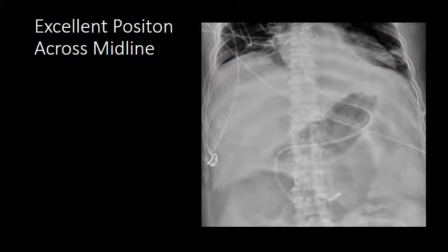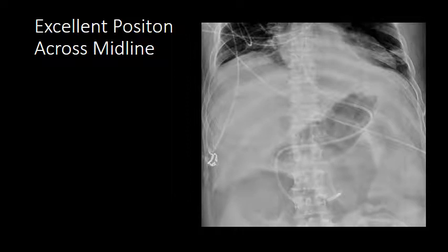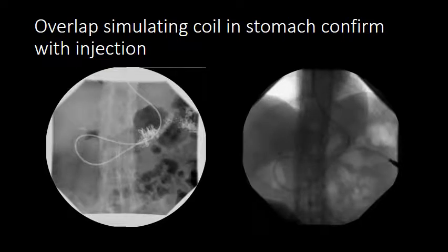Here we have a feeding catheter in excellent position. We see it course down the esophagus into the stomach with no loops or coils within the fundus. The catheter then passes along the C-like configuration of the duodenum terminating in the fourth portion of the duodenum — this has low risk for retraction and low risk for unnecessary pancreatic stimulation. At times, the patient's duodenum and stomach can overlap, making characterization of the tip difficult. To confirm location within the jejunum versus a redundant catheter folded within the stomach, simple contrast injection can differentiate based on the characteristic fold pattern of the jejunum compared to the rugal fold pattern of the stomach.